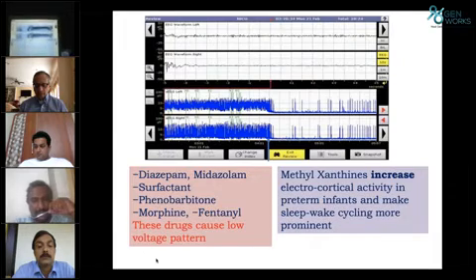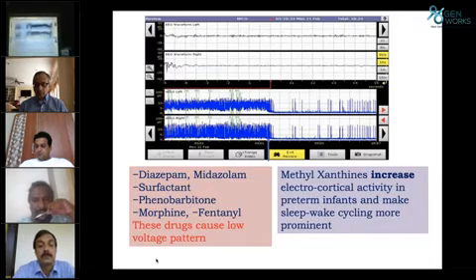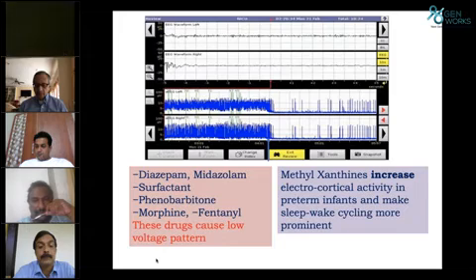After giving medication, midazolam, there is a drop in the voltage, so we have to put a mark once medication is given, at that same place. So one can see later on that the medicine was given at this point and there is a drop in the voltage after this. So this will differentiate between our intervention and some pathology. Next.